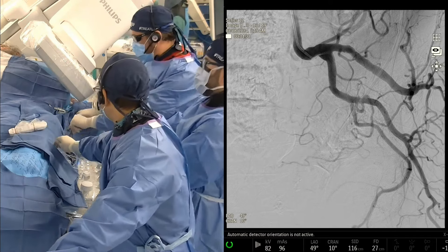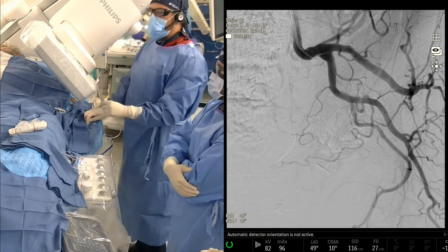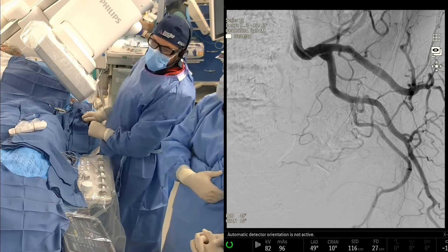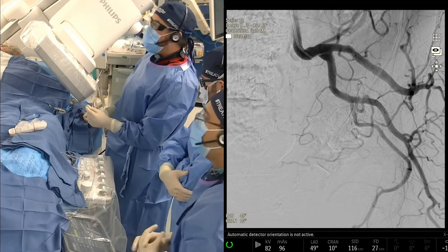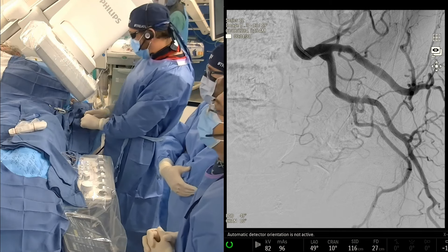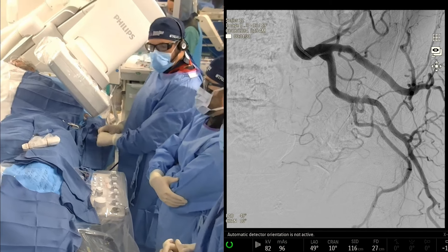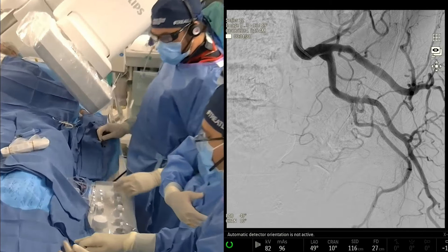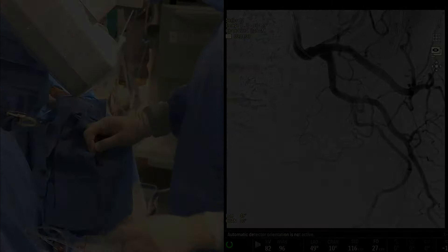So we prepped the sniper for these views. Puneet mentioned this earlier — he said 30 degrees as a place to start. This is actually 49 degrees, so we obliqued it more. I'll usually start with 30. Yeah, I think the majority of us are doing somewhere from 35 to 45 ipsilateral oblique on the side that we end up in, with a 10 cranial, like you said.